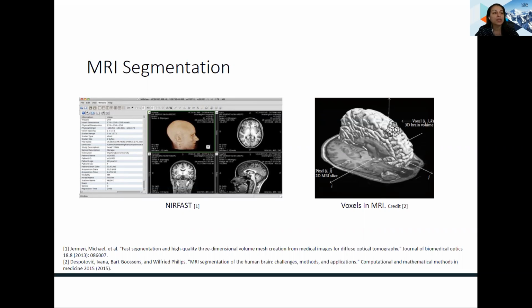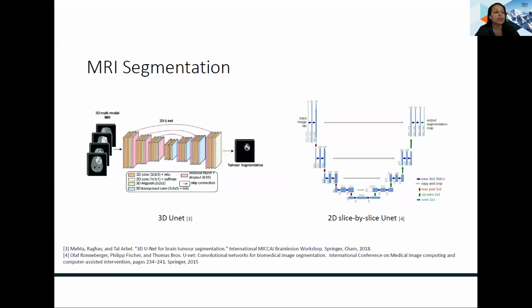Pixels in each 2D image need to be considered as a part of a 3D volume, as neighboring voxels provide contextual information that can be important for the interpretation. This information can be lost when processing each slice independently. For that, some approaches to MRI segmentation use the whole 3D volume with 3D convolutions. These approaches require training large models, as well as considerable computational power and training data to converge.